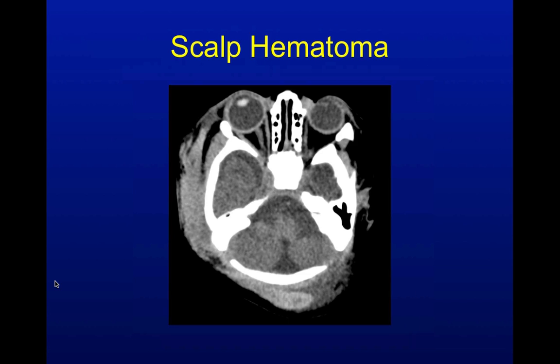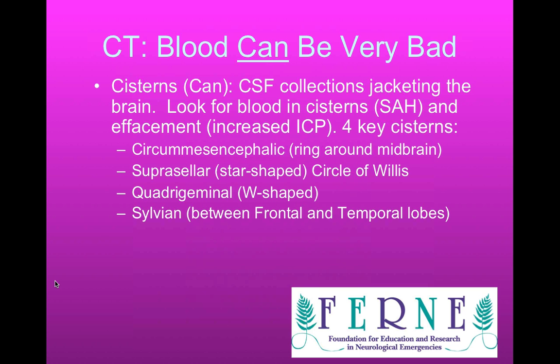Don't forget to look outside the brain. In this case, there's a big scalp hematoma here — you probably picked that up on clinical exam as well, but don't forget to look at it. Then you're going to be interested in doing bone windows to see if there's a skull fracture underneath there.